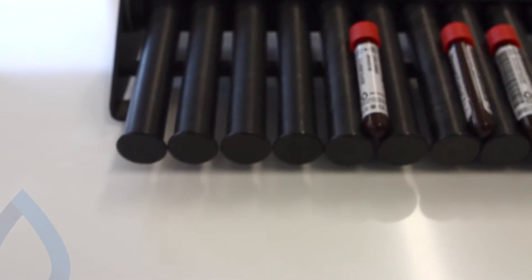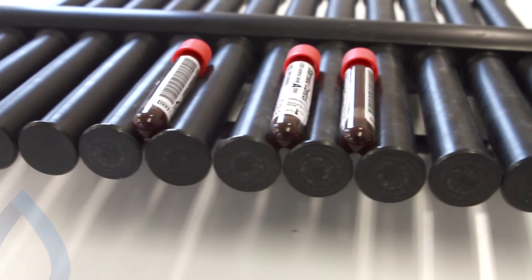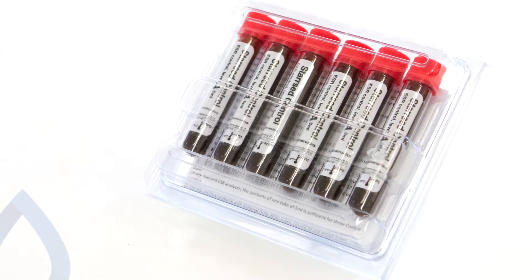Mix Star Z control for 15 minutes on a roller mixer. After that, Star Z control is ready for use. Store Star Z control always upright with the cap on top.